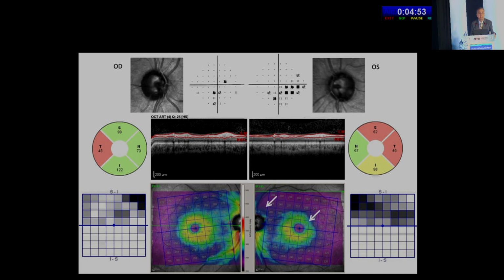Remember one rule, that in glaucoma, especially in the early stages, you should not see any abnormality in the temporal region. So when you have disease in the temporal region, when the cup is not total, it indicates it is possibly neurologic. And so even though this looks like an arcuate pattern loss, there is a loss of nerve fiber layer, but it shouldn't affect the temporal segment at this stage. And this turned out to be neurosyphilis. So think neurological if you see a temporal loss.